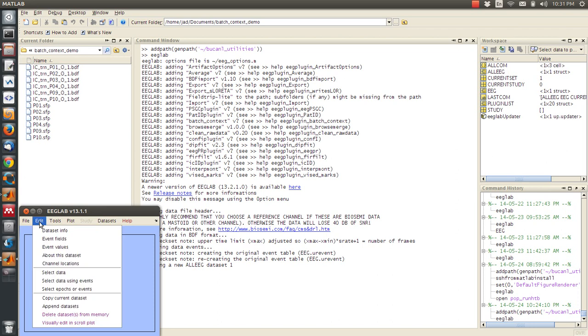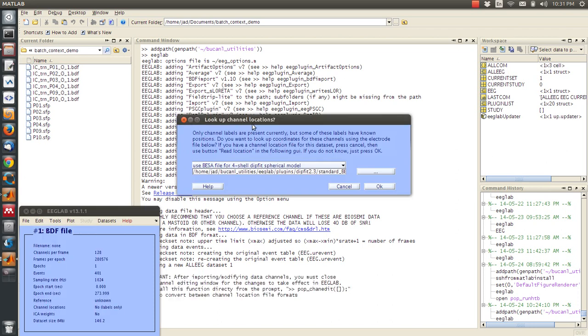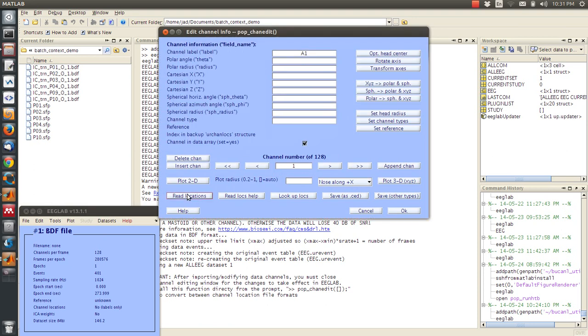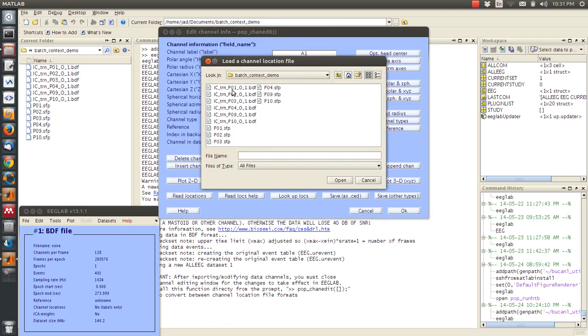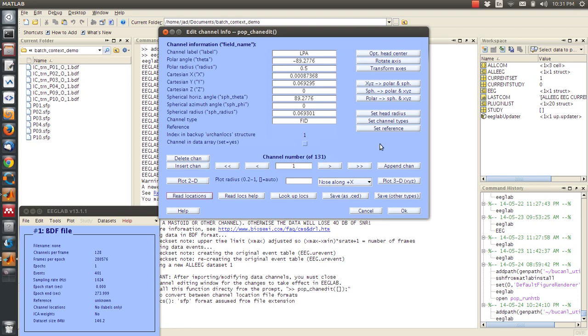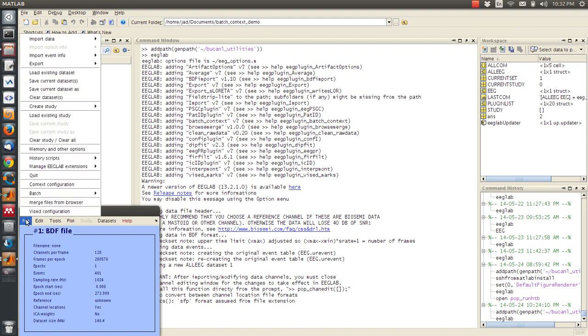What I want to do is I want to go to the channel locations and I'll cancel this and then read locations. Now this participant has their own coordinate file, this p01.sfp. So I'm going to double click on that. Auto detect is fine and okay. Now this file has the channel coordinates loaded in.